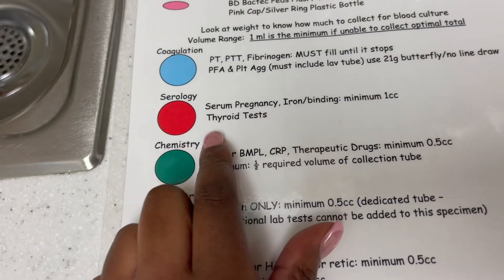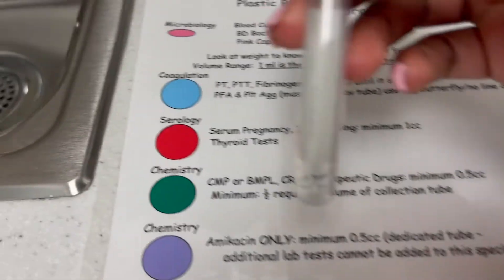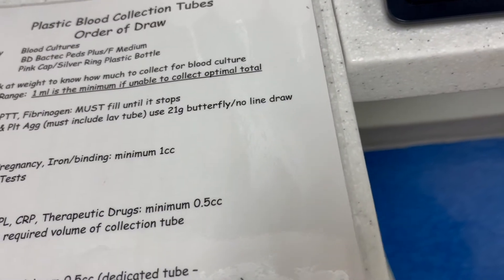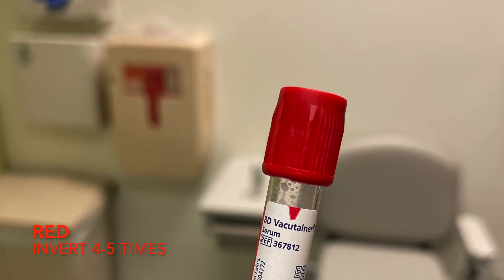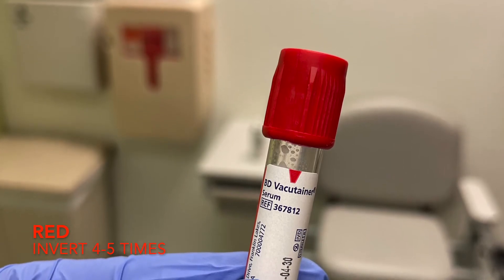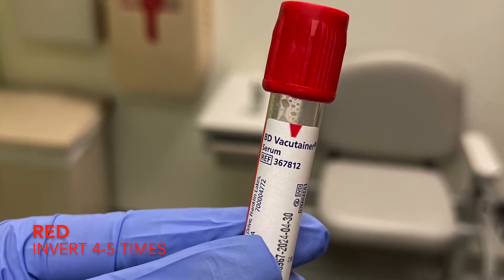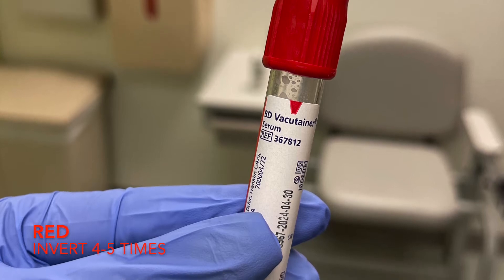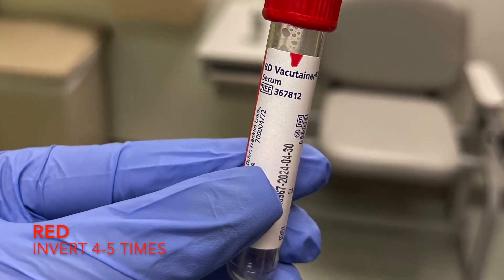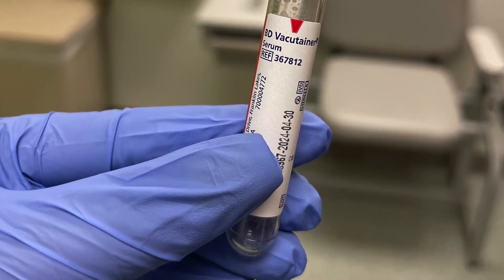Next, we have serology — they use this for iron, thyroid, and pregnancy tests. This is the red tube. They spin it down into serum. The red top is used as a clotting activator, so don't be surprised if the specimen is clotted by the time you finish labeling — that's how it's supposed to be. For every two cc's of blood you collect for a red top, you get one cc of serum. If you have multiple red tops, don't combine tests; collect one red top per test.